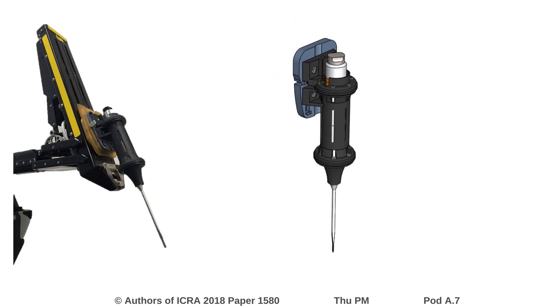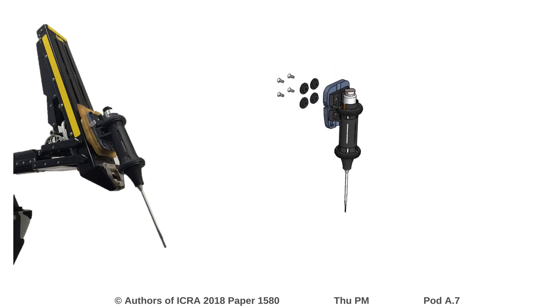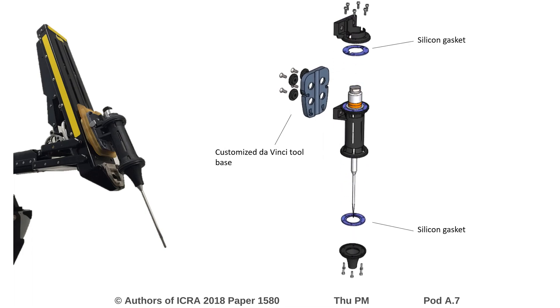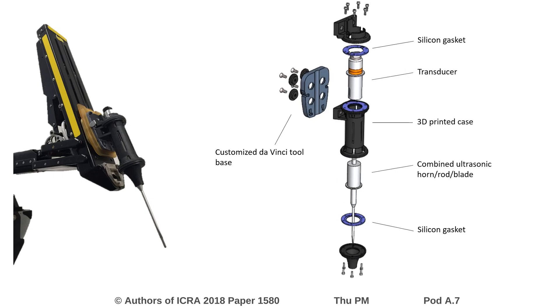This animation shows an exploded view of the design. The customized da Vinci tool base can be seen here, as well as in the image on the left. Customized silicon gaskets were developed for the mounting system. The transducer was selected off the shelf, and the remaining components of the ultrasonic system were machined from high-strength aluminum.